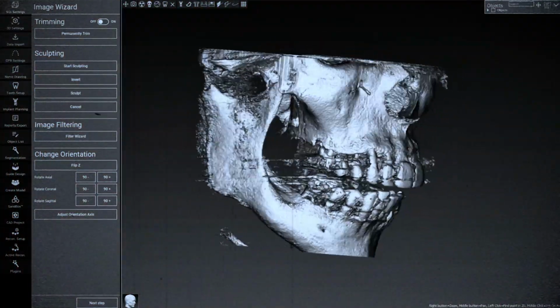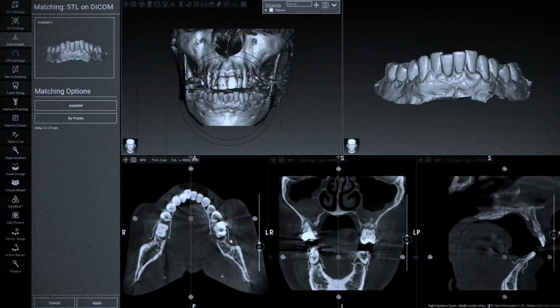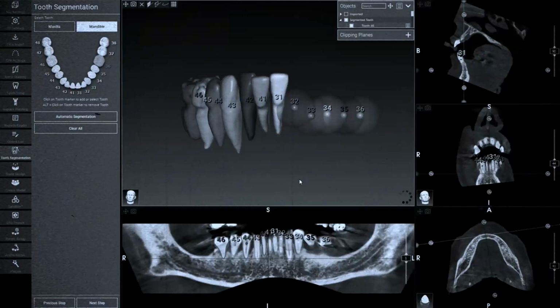Another thing that I hope is coming down the pipe is testing out treatment plans. Now, they already have artificial intelligence software that will help you decide what implant to place, how to angle it, what dimensions you should choose, etc., that syncs together with images and implant planning software, and that's all great.